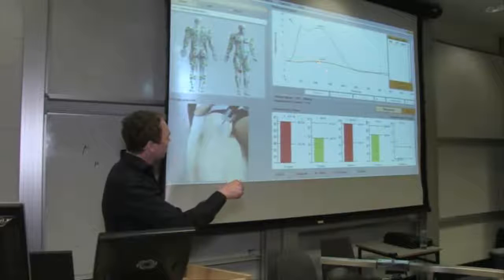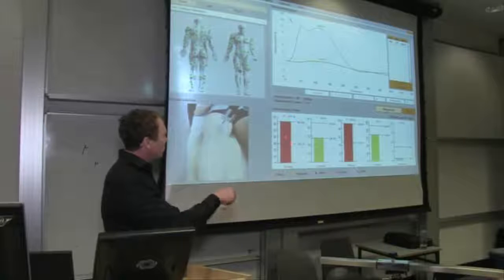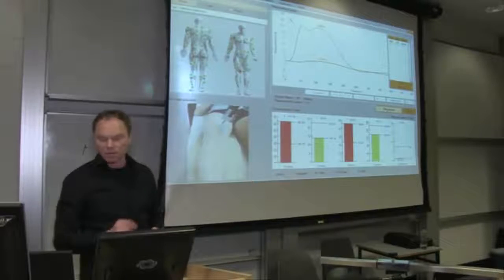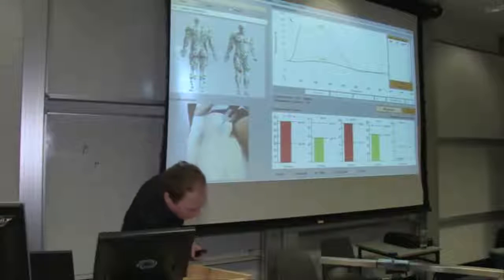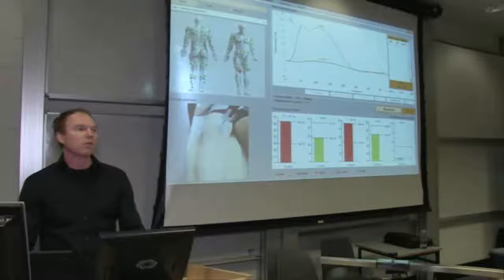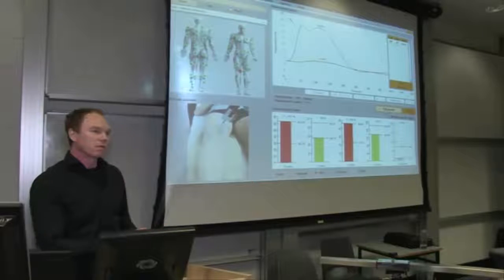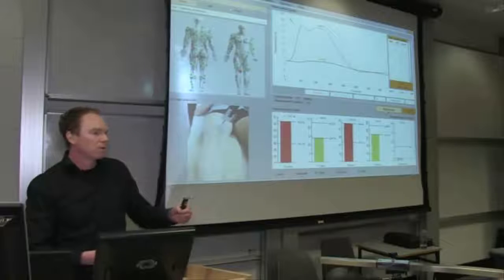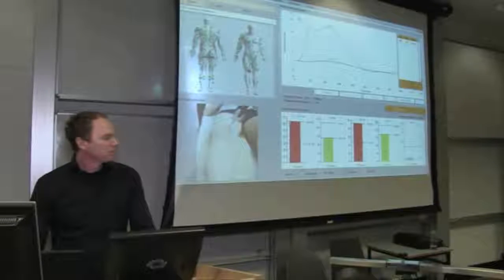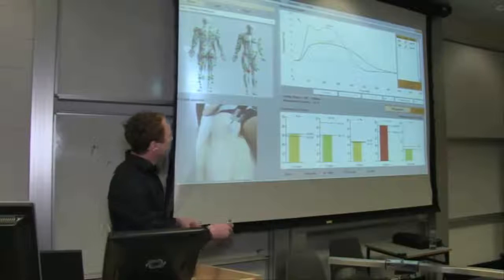So this orange curve is always the current response that I get. These numbers here now are not relevant because I'm just stimulating a very, very small portion of the muscle. So I'll go to 20 milliamperes now, around 20. You don't have to be very precise. Usually I don't even look at the scale. I just go up, up, up until I get the response. Okay, let's measure again. Now we have a good response already.